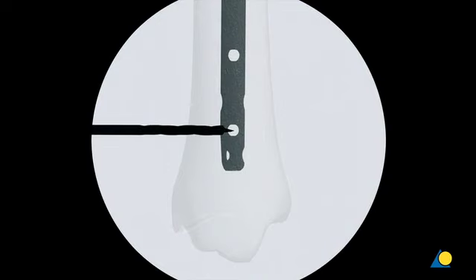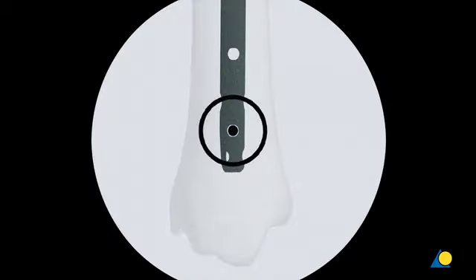Using the radiolucent drive under image intensification, the tip of the 3.2 mm drill bit is inserted through the incision down to the bone. The drive is angled so that the tip of the drill bit is centered over the locking hole. The drill bit should nearly fill the circle of the locking hole. The drill bit is held in this position while the hole is drilled through both cortices. Drilling is stopped immediately after both cortices have been penetrated. After confirming the correct position of the drill bit beyond the far cortex, the radiolucent drive is detached.